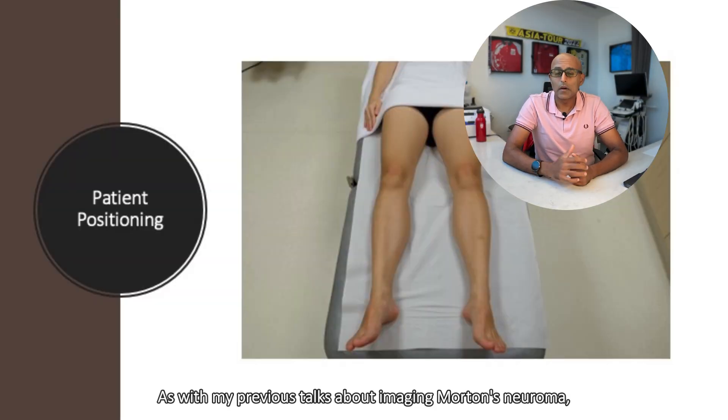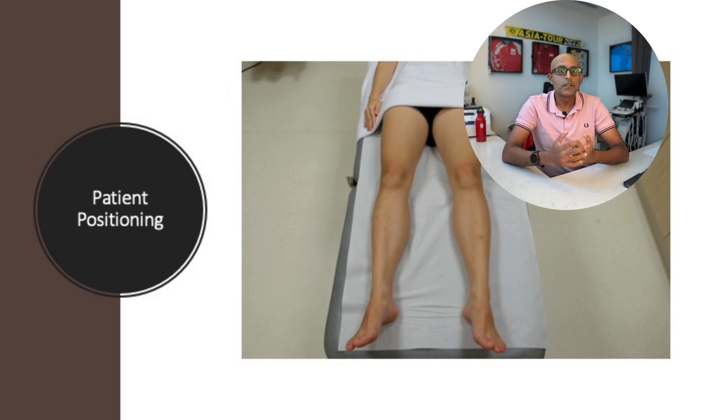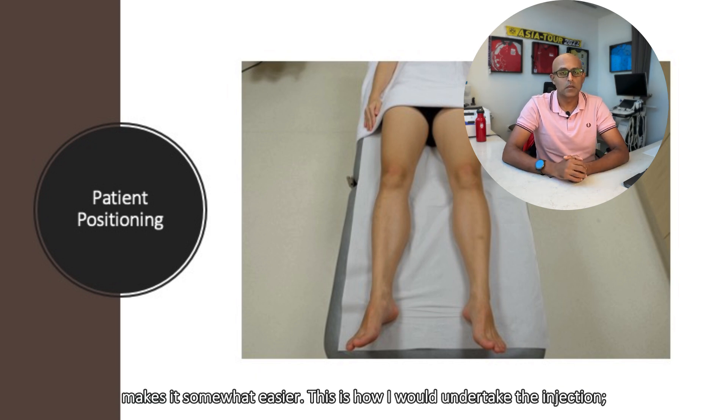As with my previous talk about imaging Morton's neuroma, I would typically have the patient lying in a supine position with the foot either resting on the examination couch or just hanging off it slightly. This should be a lot more comfortable for the patient, and for you it should be easier to manipulate the foot when undertaking the injection.